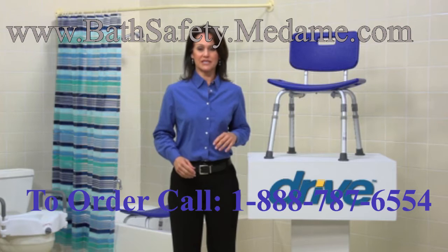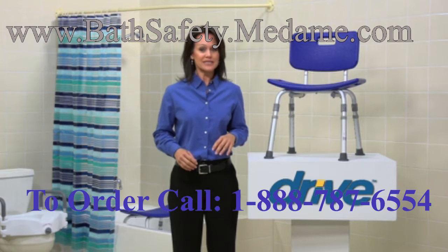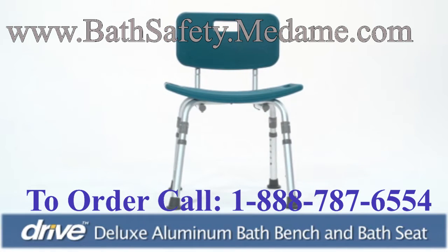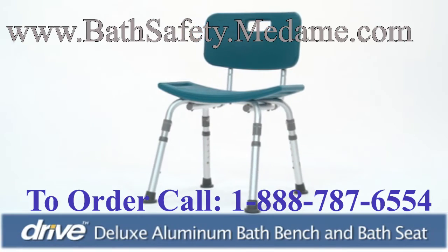Wet, slippery bathroom surfaces can increase the risk of falling. For those who desire more security while bathing, a bath bench or seat is an excellent solution. To enhance your comfort and safety, Drive Medical Shower or Tub Bath Seat and Bench provides a perfect solution for wet, slippery bathroom surfaces.